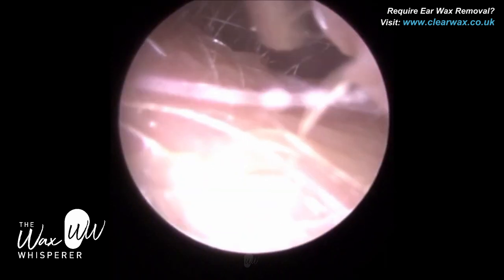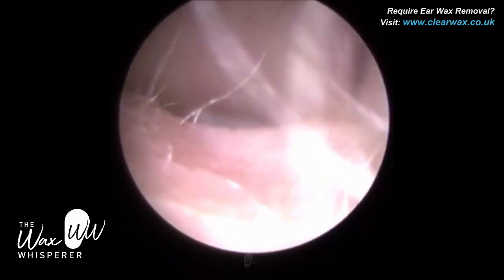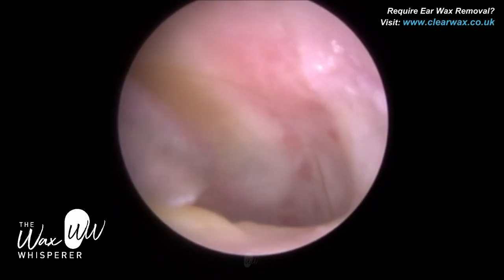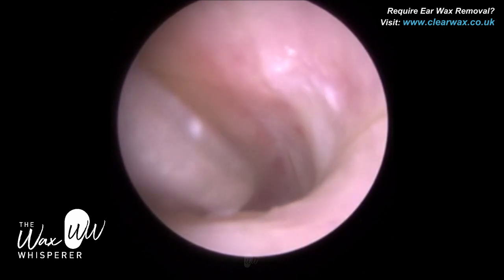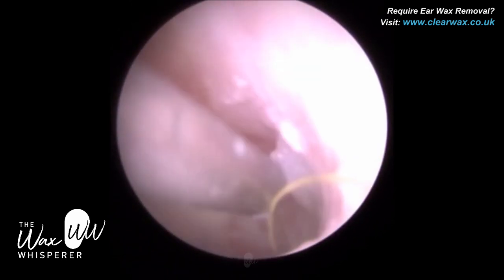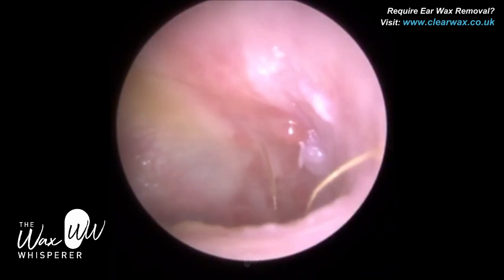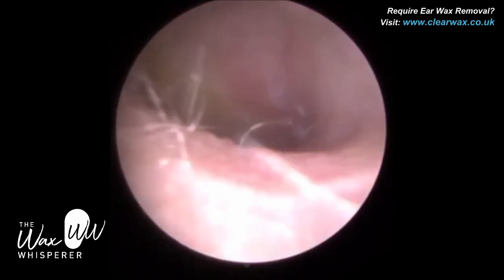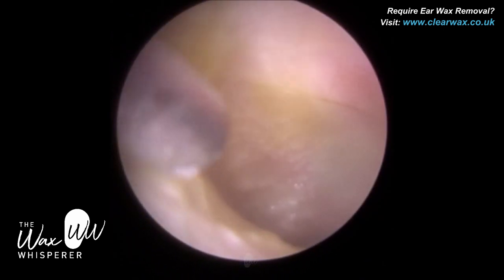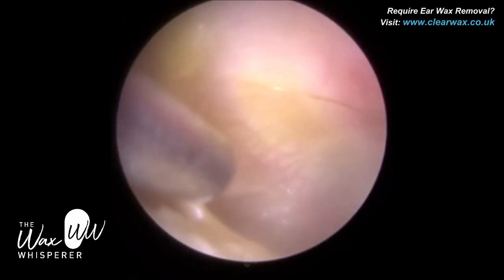This is the more interesting one. If you look at the thumbnail, the patient has granular myringitis — also known as granulation myringitis. Granular myringitis is the formation of new connective tissue and microscopic blood vessels and capillaries, typically as a result of a wound, trauma, or infection on the eardrum. What you see are these rough patches of red tissue on the eardrum. It will be revealed as I clear all this dead keratin off. It puts the hairs on the back of my neck up every time — it just looks a bit gruesome.